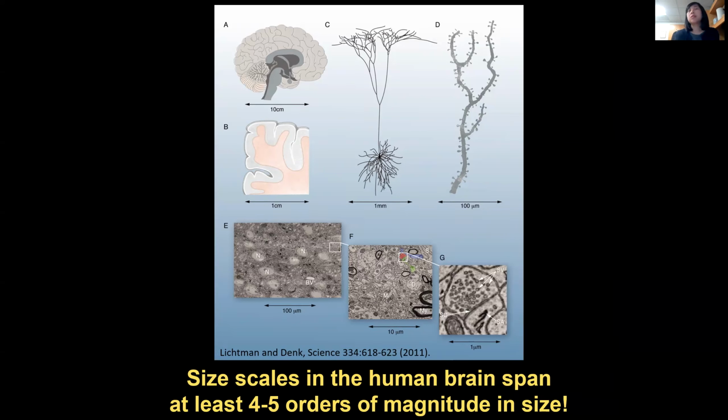And this is one of the biggest challenges, in fact, in mapping human brain structure. If we believe that understanding human brain function relies on knowing its structure, then we need to be able to bridge these scales. Tools like MRI offer the spatial range and resolution to image the whole brain, down to maybe 1 millimeter cubed voxels.